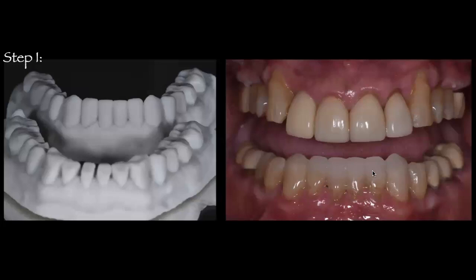Again, I'm going to connect all these teeth together, and I do this because it makes it very quick, very easy, and very predictable. You can see that the wax up, because of that clear PVS, is so runny, it literally adapts beautifully to this wax up. And because I only asked the lab to add wax from the fracture surfaces all the way to the new position of the incisal ledges and canine cusp tips of those mandibular incisors and canines, you can see that there's nothing on the cervical third.